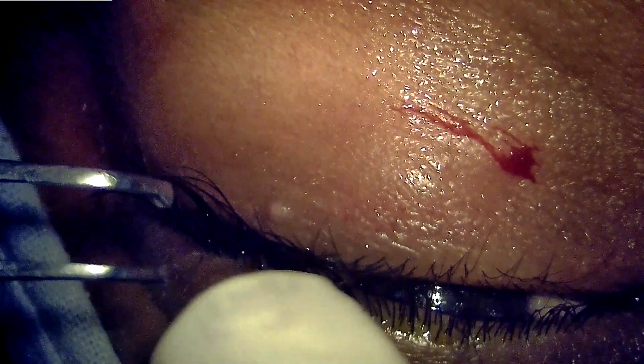After giving the field block, it is very important to properly massage the infiltrated local anesthetic agent to achieve a good effect. Using a tooth forcep to hold the lid margin, we are also able to judge the effect of the anesthesia.